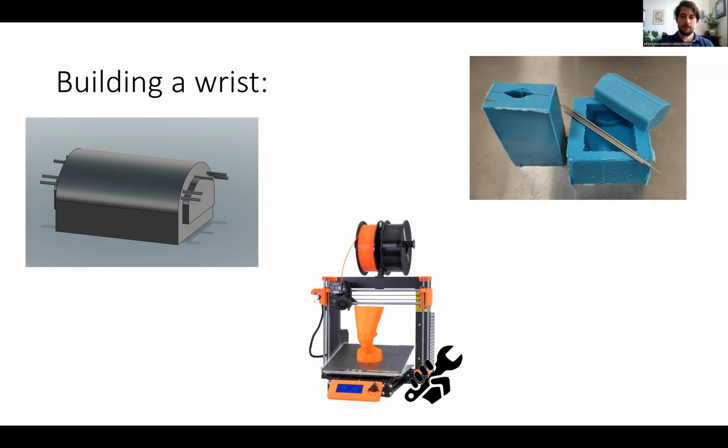So what I was doing was I was trying to pour one of these basic blocks and I made a mistake and it had a dent in it. And so I tried to literally just hand pour more ballistics gel on top of the mold. And it kind of worked, but it was really easy for me to peel off. But then I realized, hey, you can put two pieces of ballistics gel right next to each other, and on ultrasound it looks like a fascial plane.